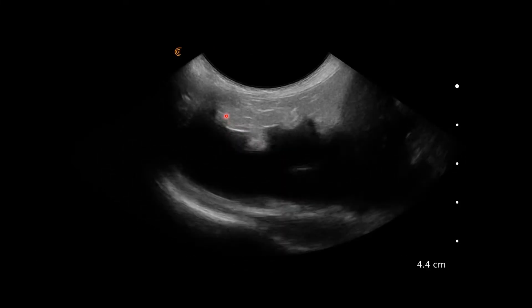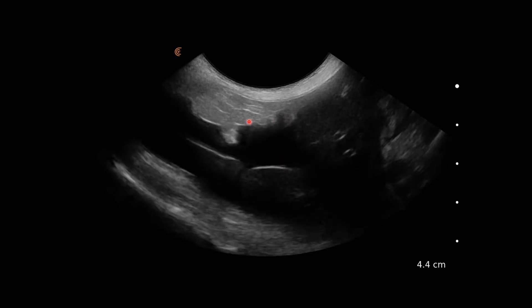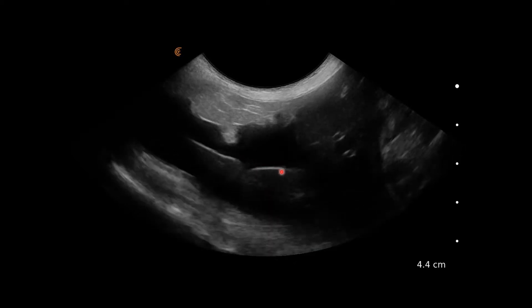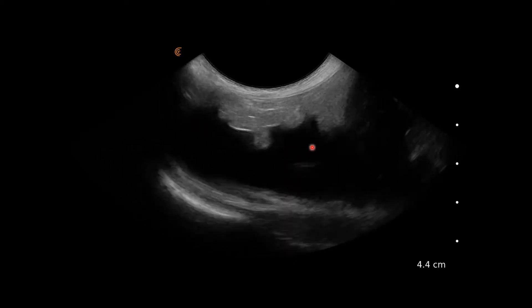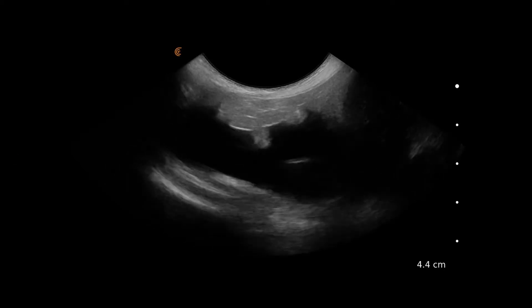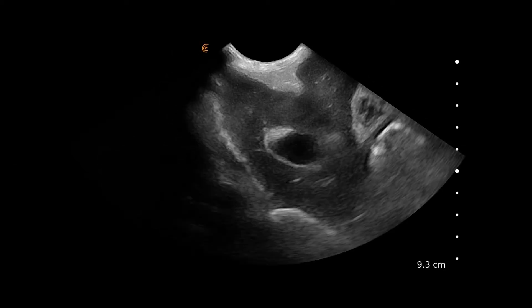A close-up of that area: we've got mesentery here and the edge of the liver, and this anechoic content here is free fluid. Here we've got the gallbladder. The liver is hypoechoic, and we can see that because the portal veins are standing out more obviously than they would normally.